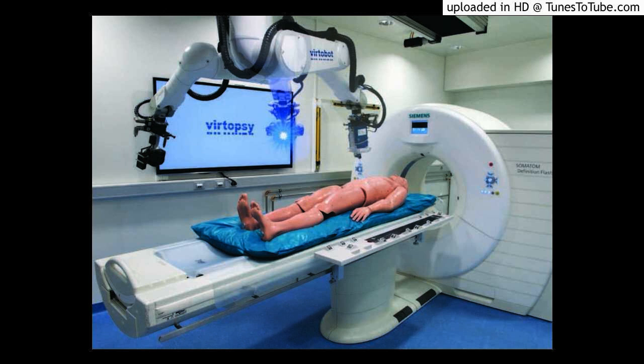CT scans are performed using mobile CT scanning equipment. Maximum intensity projection, MIP, is a very fast imaging technique which takes just several minutes to create a radiographic model of the dead bodies to be investigated.